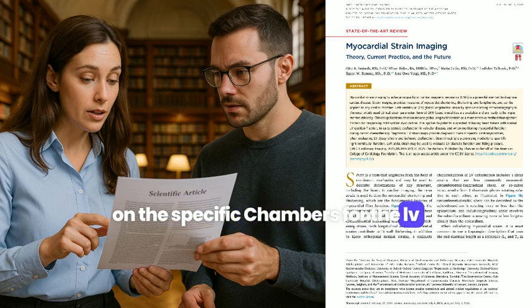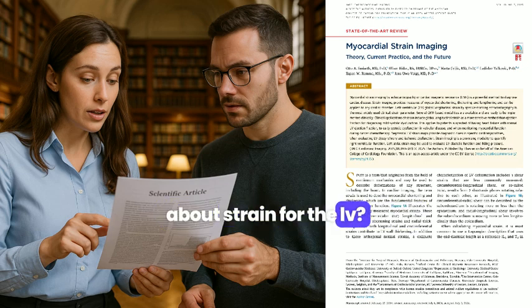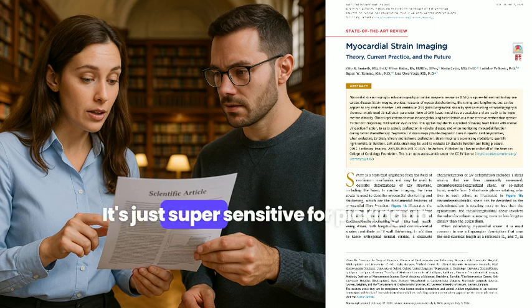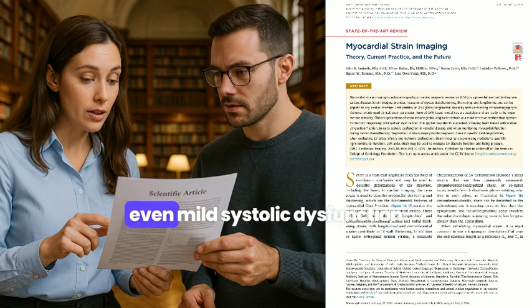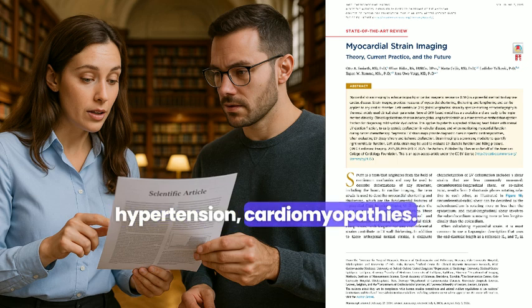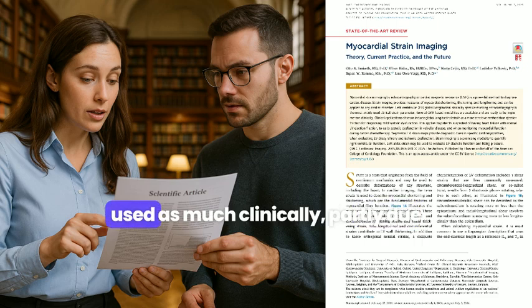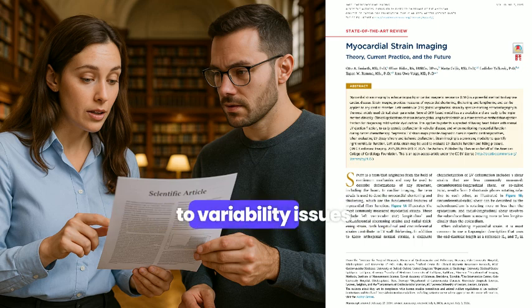Okay, let's zone in on the specific chambers. For the LV, what are the key clinical messages about strain? For the LV, global longitudinal strain, GLS, is the star. It's just super sensitive for picking up even mild systolic dysfunction, often before the ejection fraction drops. Across many diseases: heart failure, CAD, diabetes, hypertension, cardiomyopathies. It's broadly applicable. Circumferential and radial aren't used as much clinically, partly due to variability issues we mentioned.